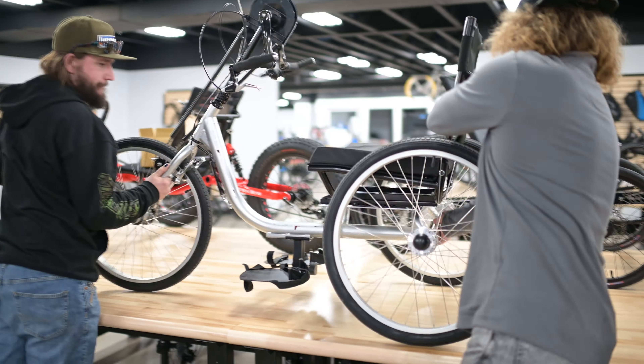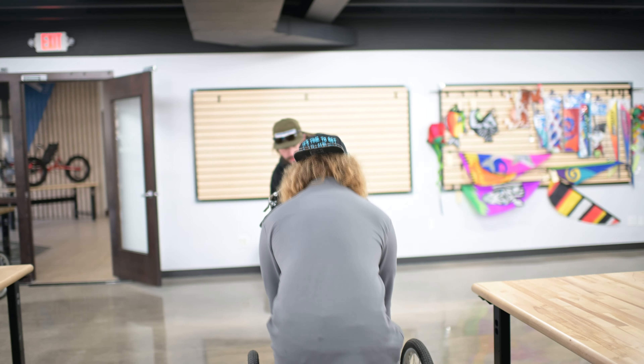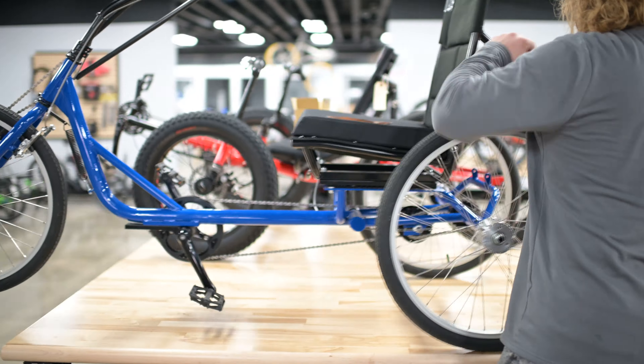One of the main questions we get is: who are these trikes for? We've had customers from all different backgrounds. Riders with limited use of their legs find increased freedom and an excellent workout through the use of a hand cycle. A lot of our customers who already have traditional recumbent trikes will purchase a hand cycle because of the upper body workout that it provides. Both of these trikes are stable, quick, and have a weight capacity of 300 pounds.